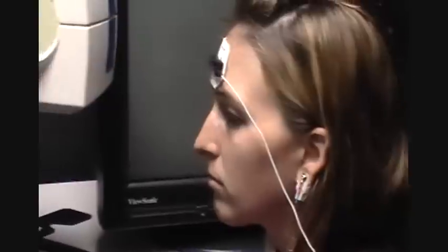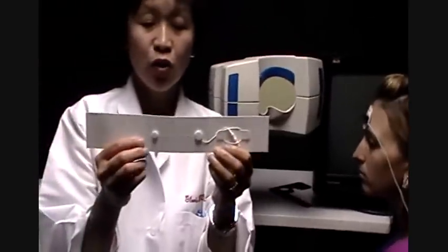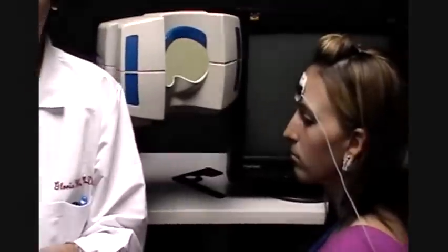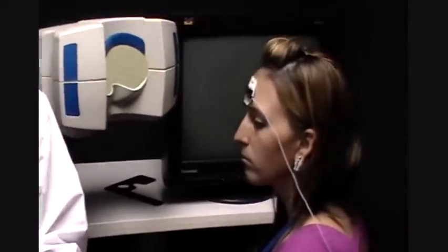All this is placed on the amplifier. Then we're going to put in the eye electrodes. Previously we have used jet electrodes and Burian Allen electrodes, but we like this system. This is the DTL electrode. The wire is extremely thin — approximately 50 microns in diameter, like a 10-0 nylon suture. The filament is a silver-coated filament.